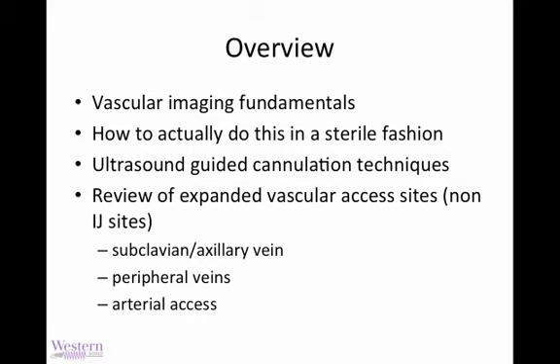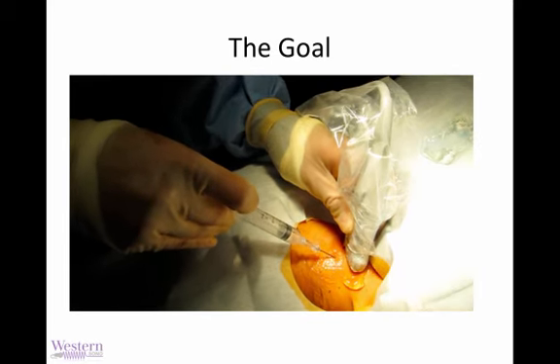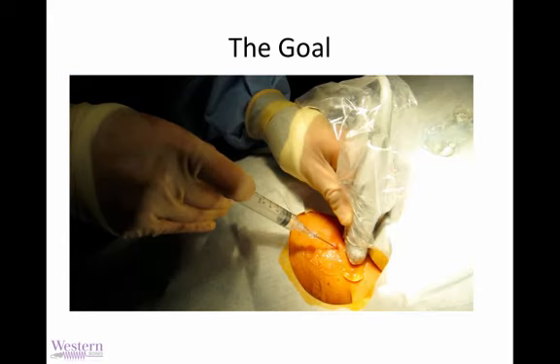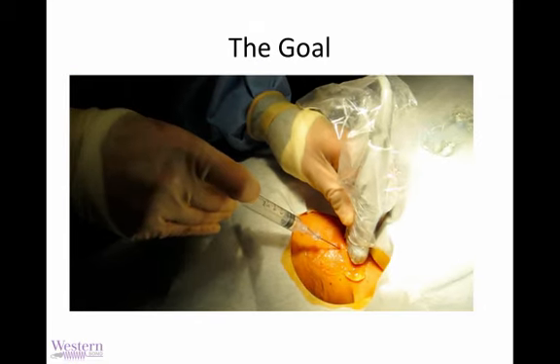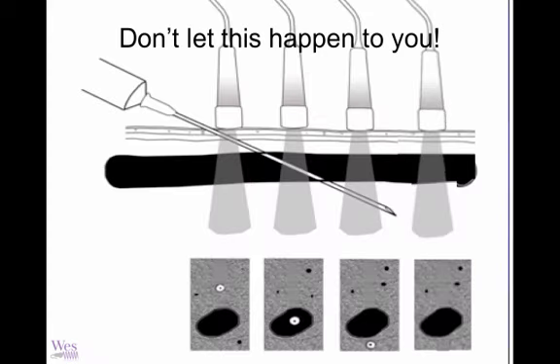I'd like to acknowledge many of the great audiovisual materials in this presentation come from Dr. Arun Nagdev, who is featured here, and he is the Director of Emergency Ultrasound in Oakland and an excellent ally and an excellent educator. So thank you, Arun. Of course, the goal will look something like this at the end: calm, poised, ultrasound guided, sterile, rapid. All those things will be actualized after you sink your teeth into this material and get some hands-on practice.